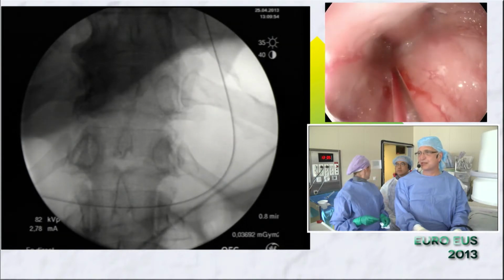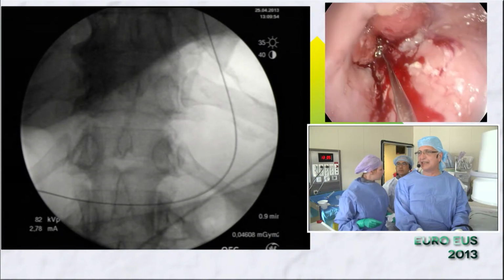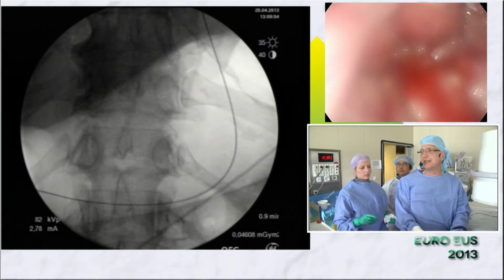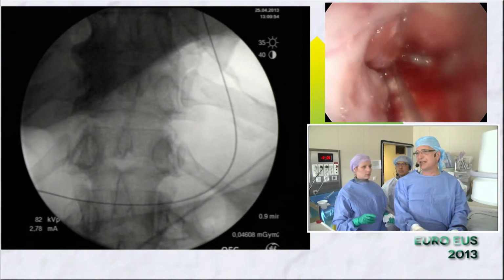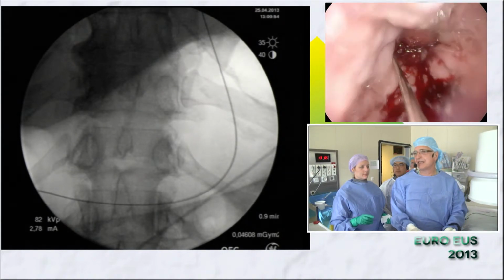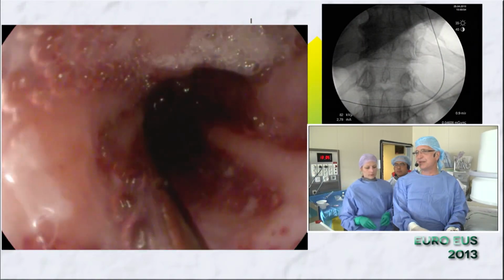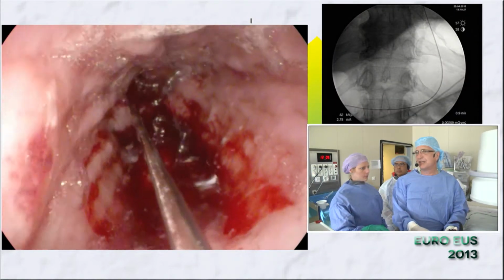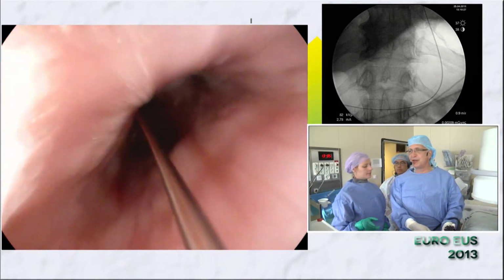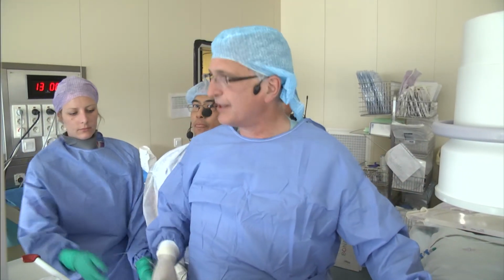I was able to pass with my scope, so that means that I don't need to dilate. We are now at 45 centimeters. So I have a tumor of 7 centimeters, 35, yes. And then probably a stent of 10 or 12 centimeters will be enough. I never hesitate to have a stent which is a little bit too long, but maybe, do you have 10 centimeters? Yes. Okay, I probably need only 3 minutes.